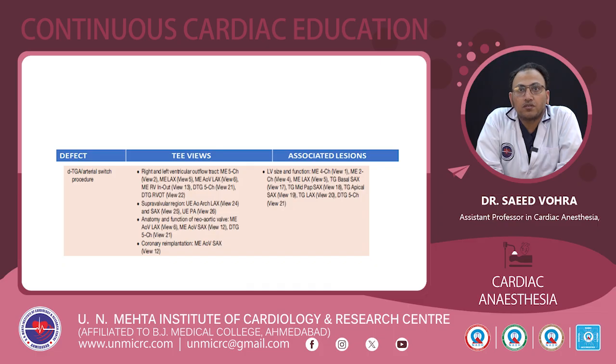Coming to the associated lesions, the LV size and function can be assessed by the four-chamber view, two-chamber view, long axis view, transgastric basal short axis view, mid-papillary short axis view, transgastric apical short axis view, and long axis view, along with the deep transgastric five-chamber view.